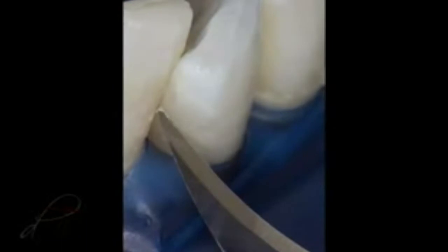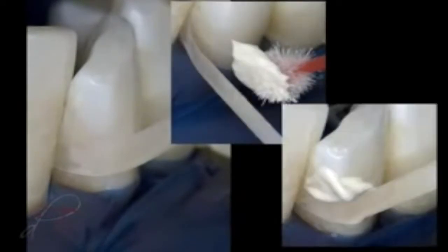The mylar strip was removed and the interproximal region was inspected for any residual composite resin tags or overhangs. The excess residual resin was removed with a surgical blade, a number 12 BD Bard-Parker by BD Medical. The proximal surfaces were cleaned and smoothed with a loose abrasive diamond polishing paste, which was carried into the interproximal region with finishing strips using the ET composite polishing system by Brasseler USA.